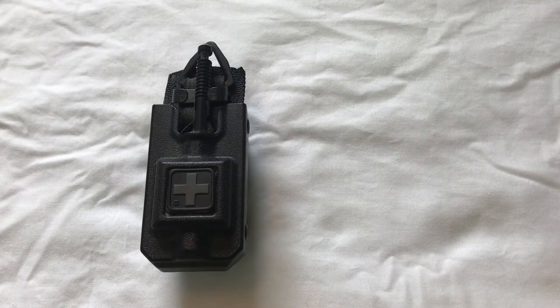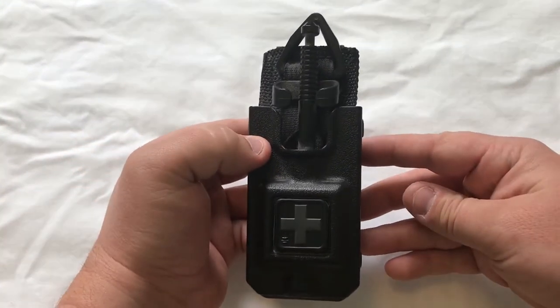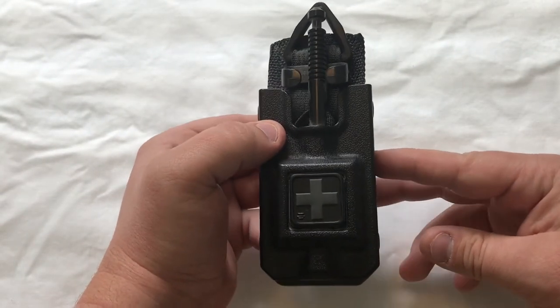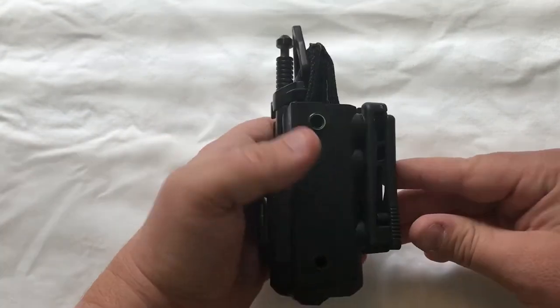Hello everybody. Today I wanted to talk about the tourniquet holster that I use on my duty belt. We're looking at the 1110 tourniquet holster. Right now I have the soft tourniquet in there — that is my preference to be using on patrol and have open on my duty belt.